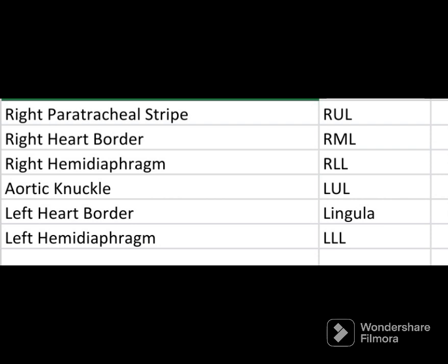If the right paratracheal stripe is silhouetted, the lesion should be in the right upper lobe. If the right heart border is silhouetted, the lesion would be in the right middle lobe. If the right hemidiaphragm is silhouetted, the lesion would be in the right lower lobe.